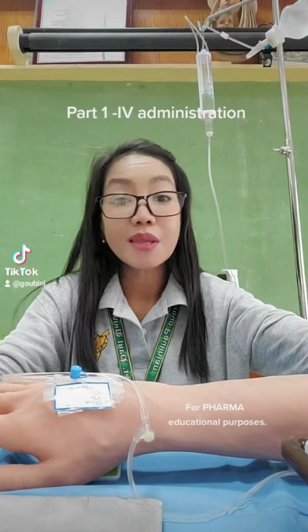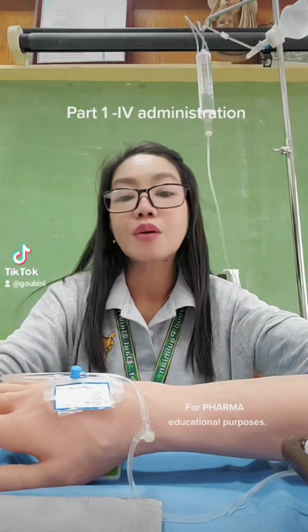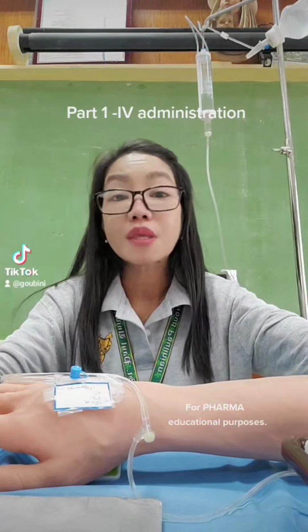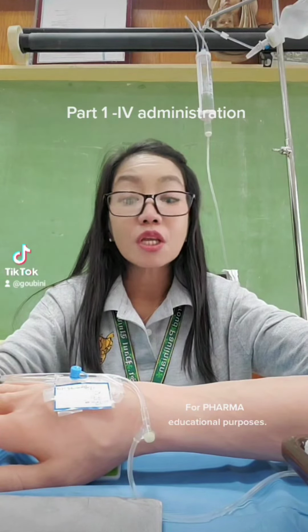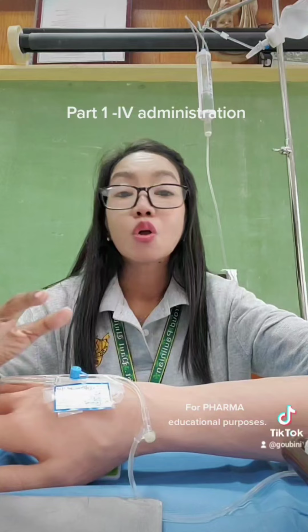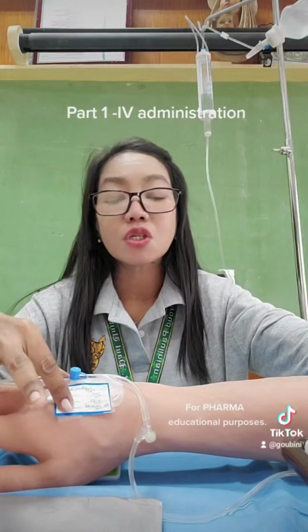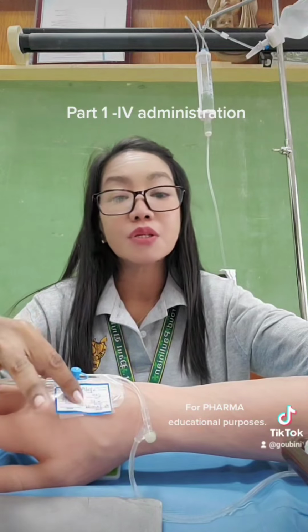Certain medications are being administered to the systemic circulation through the intravenous route. Now we have medications ordered by the doctor that are to be given by IV injection or infusion, meaning they are given directly into the vein of the patient using a needle such as this one. There is actually a thin plastic tube called an IV catheter or IV cannula inserted into the vein of the patient. This allows multiple doses of medication to be administered.